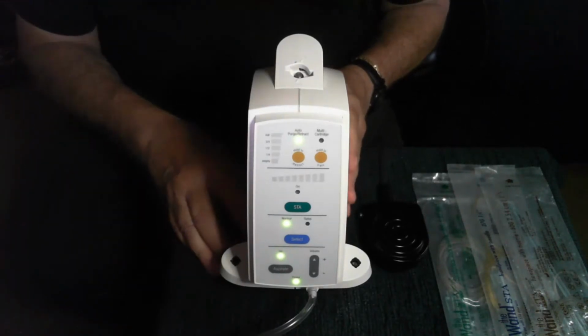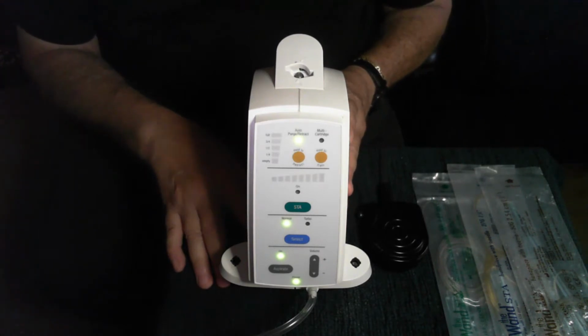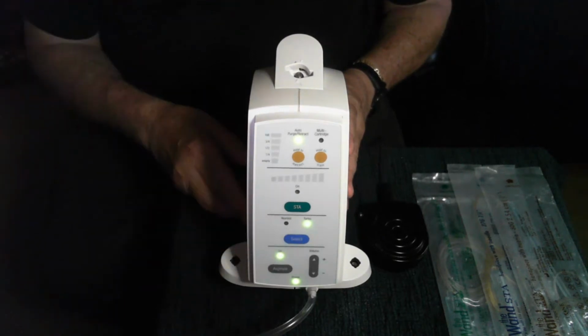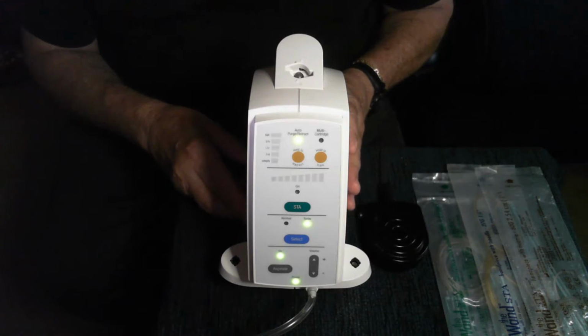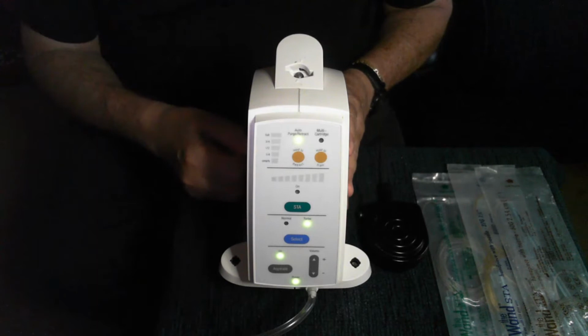At the normal flow rate, we have 2 flow rates. We have that control flow of 1 drop every 2 seconds. And then we have a rapid flow, which I'm going to demonstrate to you. That would take about 50 seconds to deliver a full cartridge of anesthetic. Then we have a 3rd flow rate, which is called the turbo flow. And that is a flow rate we're going to use whenever we are going to do an intrapulpal injection where we need force and pressure.